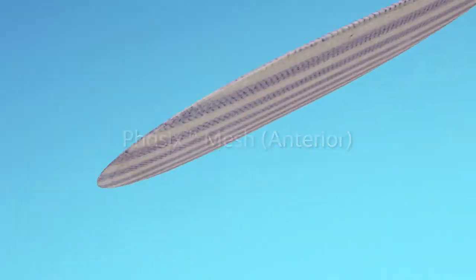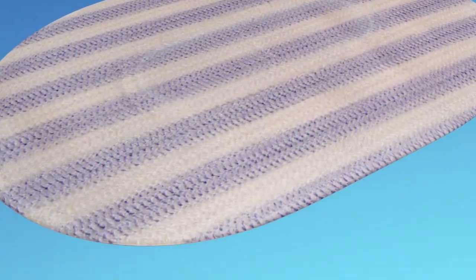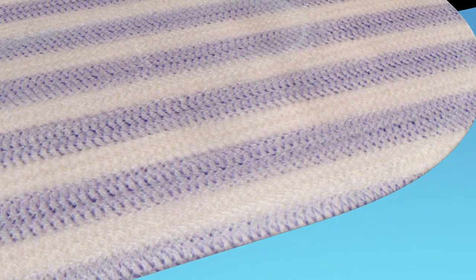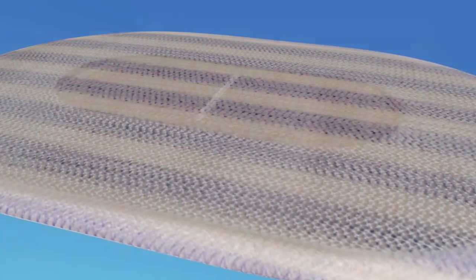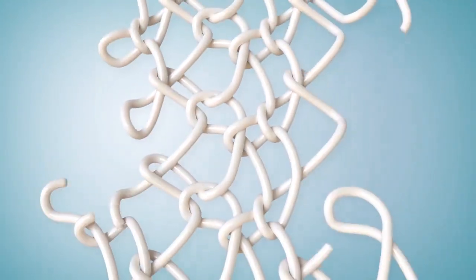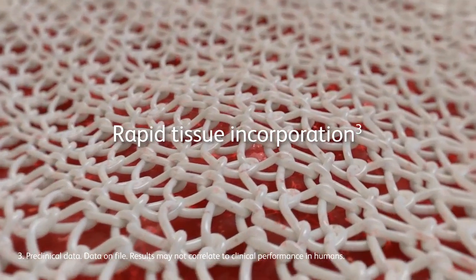Comprised of Phasix and Phasix ST Mesh, the mesh helps create a strong durable repair with no permanent material left behind. The clinically proven Sepra Technology hydrogel barrier on the posterior side helps minimize tissue attachment. Composed of a biologically derived monofilament mesh made of poly-4-hydroxybutyrate, Phasix Mesh has demonstrated rapid tissue incorporation through its open monofilament scaffold in preclinical studies.